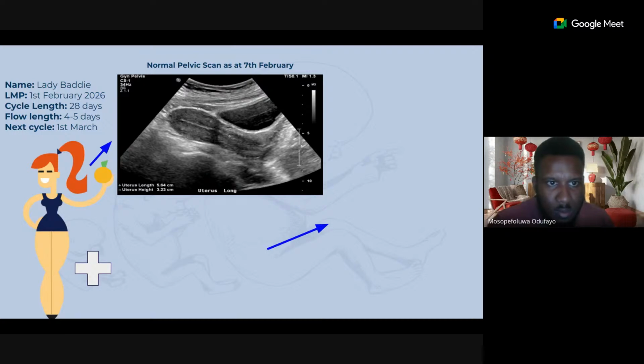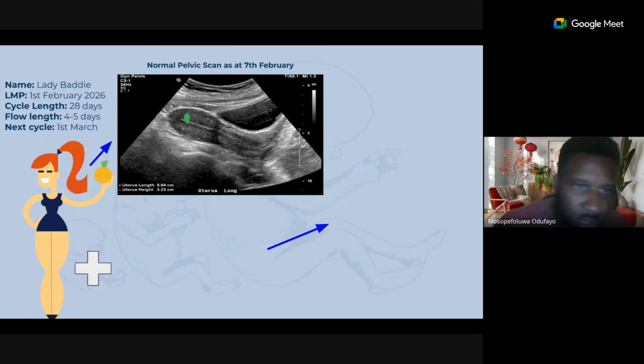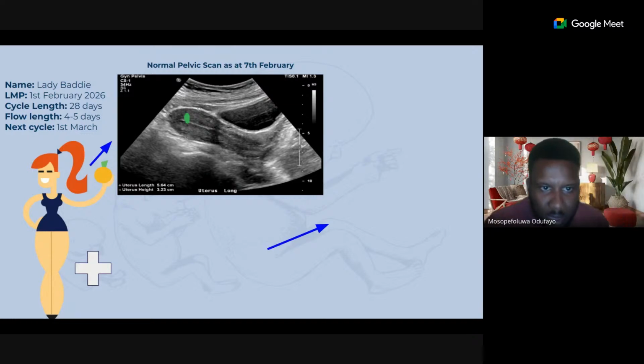So this here is the endometrium, that white line. Then we have the uterus here, and right in front of it we see this black hole, and that's the bladder. That's the way it looks, just like this many times. This is a perfect non-pregnant uterus, and this is the way it ought to be for her every single time. She's excited because nothing is wrong with her.